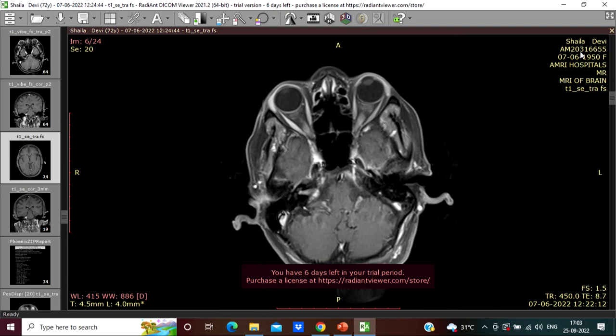The more the tumor grows, the more the facial nerve is stretched, the more it becomes ribbon-like. Though still the translab gives you the best opportunity to identify it in the beginning. So once we open the intraauditory canal, the first thing I'm going to show you is the facial nerve. Once you see the facial nerve, the positive identification helps you preserve it when you remove the tumor lower down.